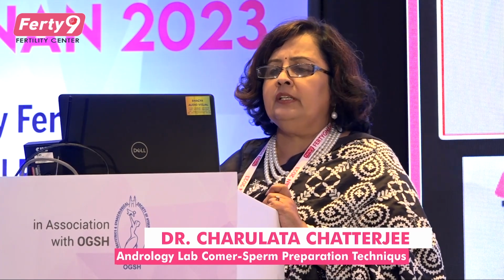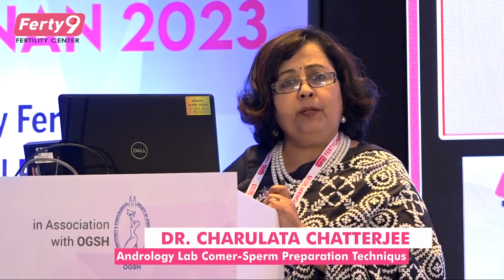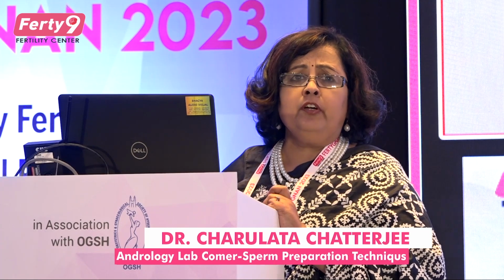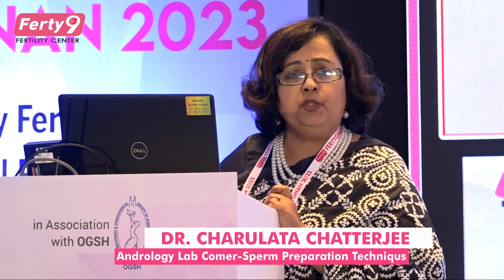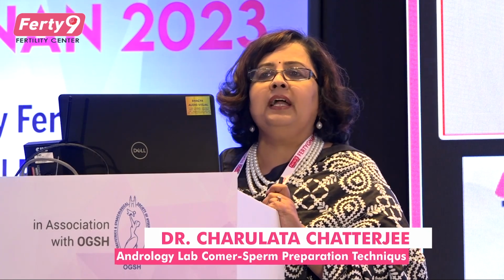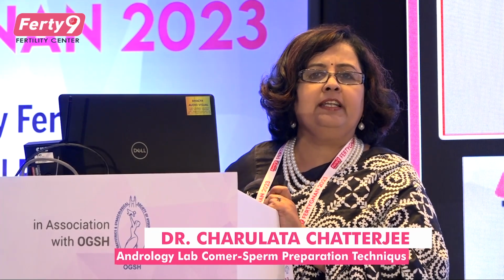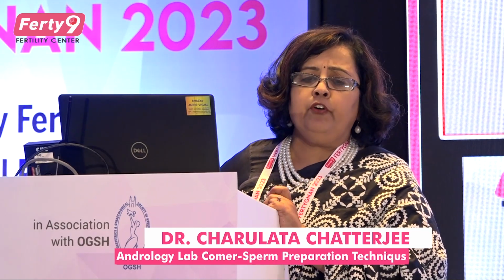So for sperm preparation, there are many basic methods and advanced methods. I am not going to talk about sperm selection, only sperm preparation, the advanced and the basic. So first of all, why do we need to prepare the sperm? Can't we directly inseminate the sperm in case of IUI? The answer is no. We have to isolate the motile and the normal morphological spermatozoa. We have to eliminate the dead spermatozoa, other debris and everything that is hindering in the semen, so that we can prepare the sperm for either IUI, IVF or ICSI.